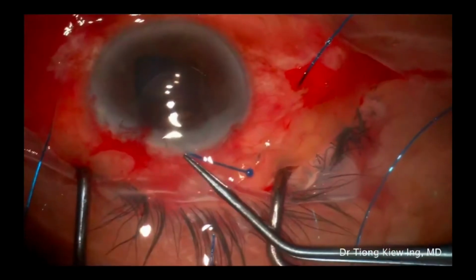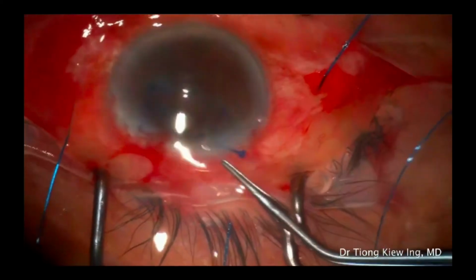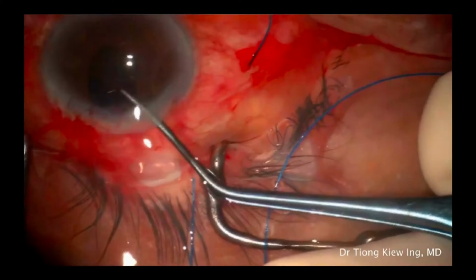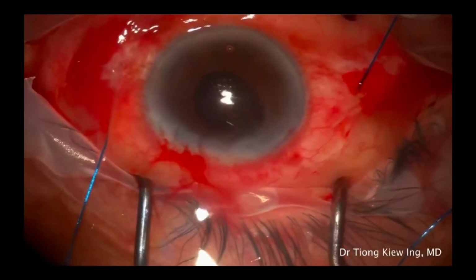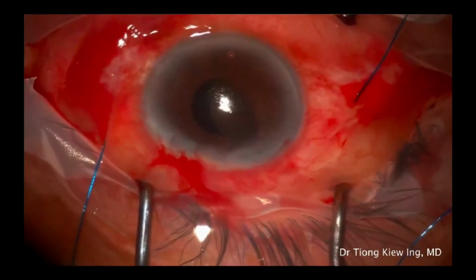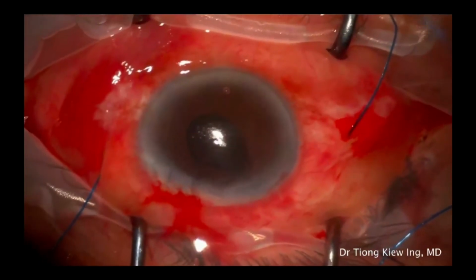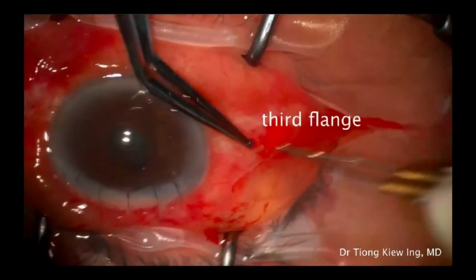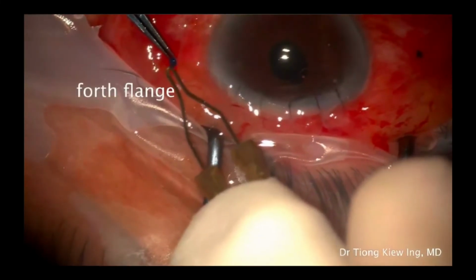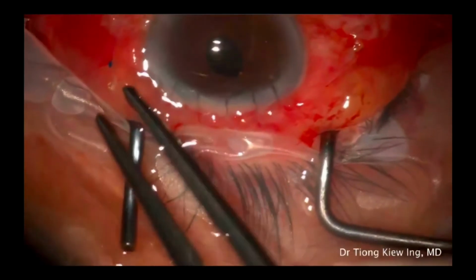The intraocular lens is then inserted into the anterior chamber with the help of the forceps. Intraocular lens is then centered via the adjustment of the Prolene sutures at both sides. Once the intraocular lens is in place, remove the excessive Prolene suture at the base and make the third flange. Similar procedure is repeated on the other side and make the fourth flange. The flanges are then buried under the conjunctiva.